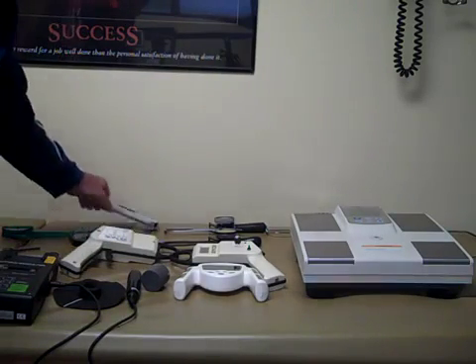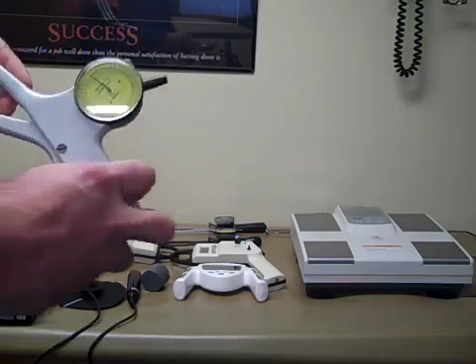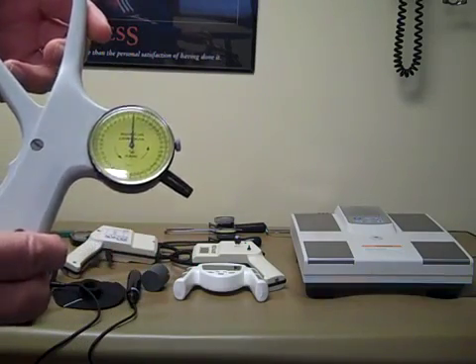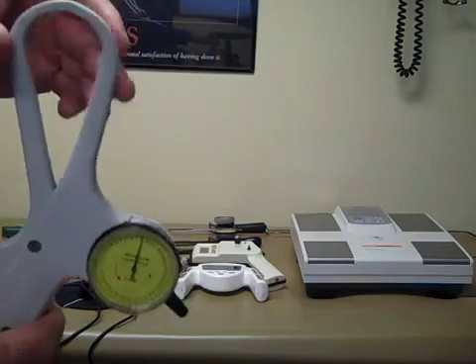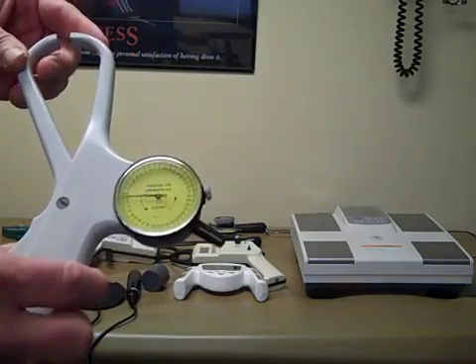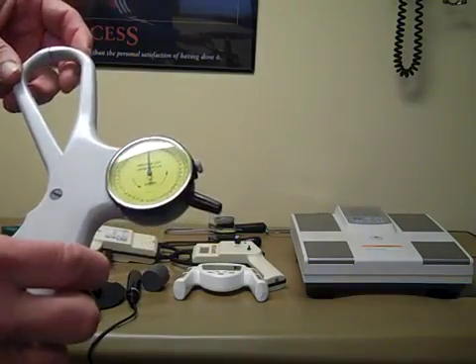Lastly, we have a Holton caliper. These are made in England and are probably one of the fancier calipers. These go all the way around 40 millimeters in one rotation. The blades are about the same width as the Harpendens. These are fairly expensive, but a very, very nice caliper also.